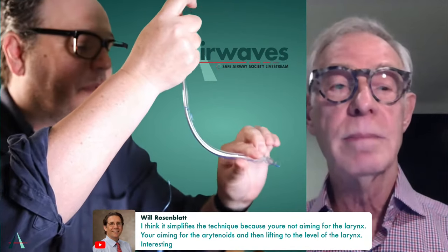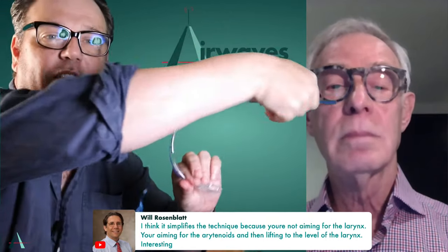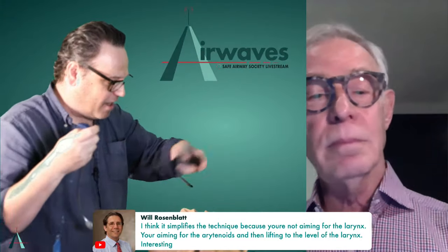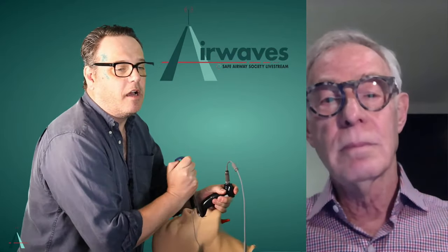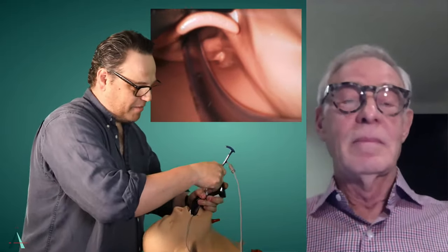And then once you get the tube into that point where it's at the lines on the tube, then the stylet comes out. And as I was saying to you yesterday, Richard, I find that it's actually easier to do a lot of this myself. So you notice once I get the tube in, I will slide that off. Oops, sorry. See, this is why it's not showing off, Richard. There you go. And then I grab the tube there so that I can actually pull that out myself.